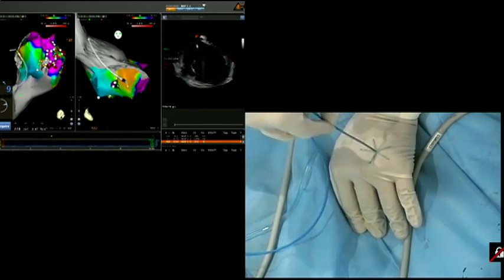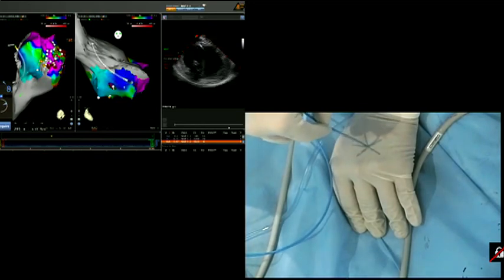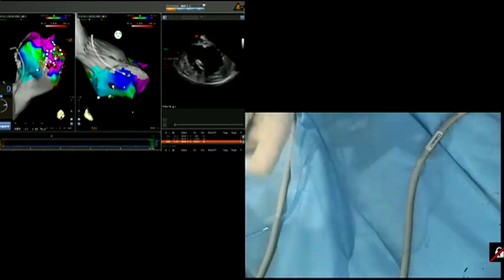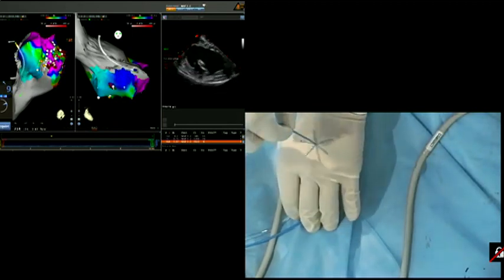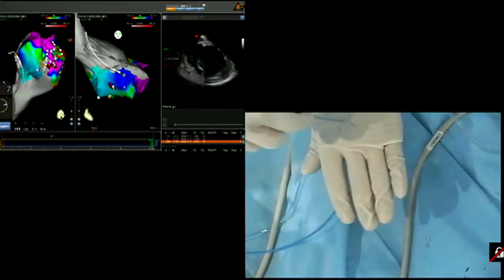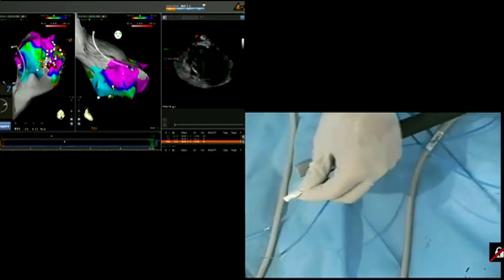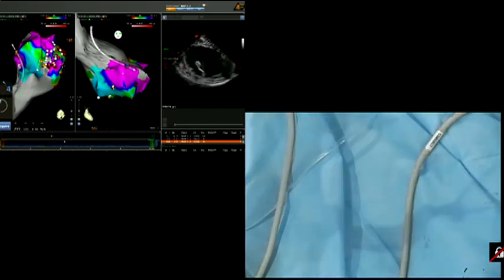us to have higher quality maps. In anterior infarcts, if we need to map towards the inferior area, if the papillary muscle allows us to do it and the epicardium, we can collect a lot of information for high density mapping. The catheter needs preparation. It has to be irrigated. So I need to irrigate for the penta.